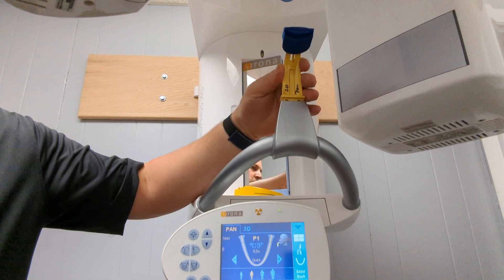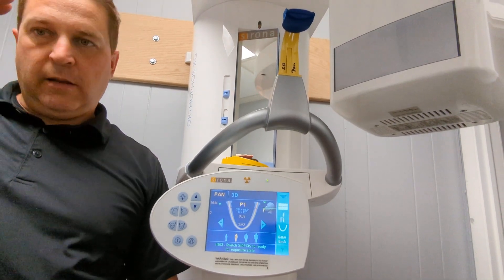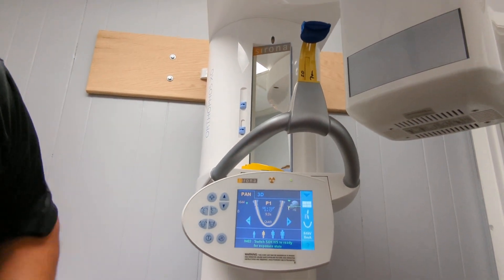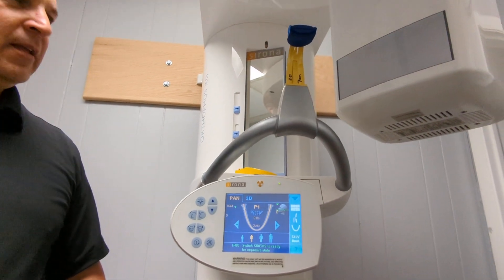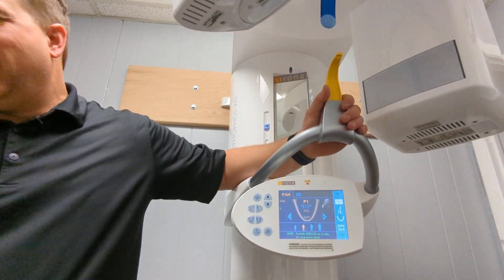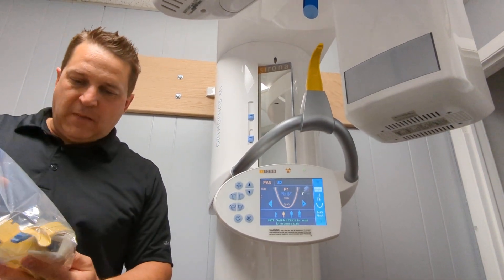You always want the occlusal plane down a little bit for panorex — not level, not up, not too far down. Just down just a little bit, about right there. When that bag runs out we don't need them — you can just go right on it. They're fine, but you've got some if you want to use them.